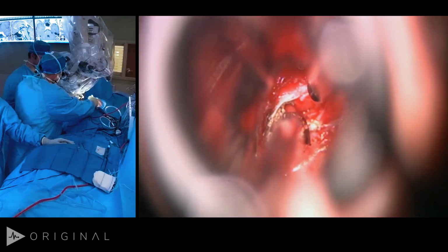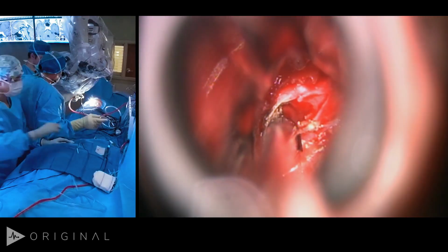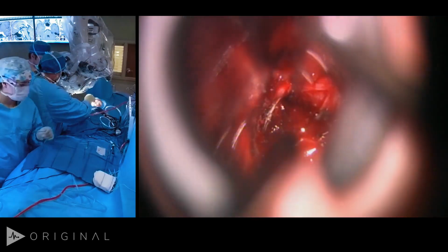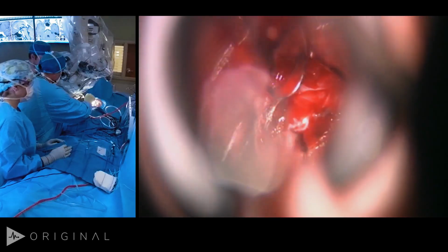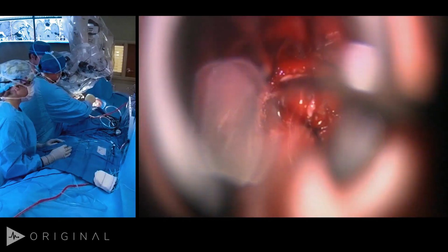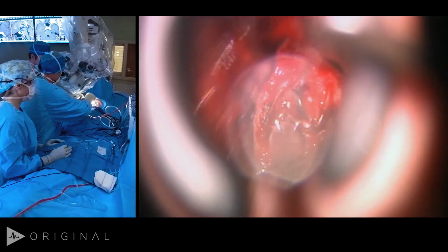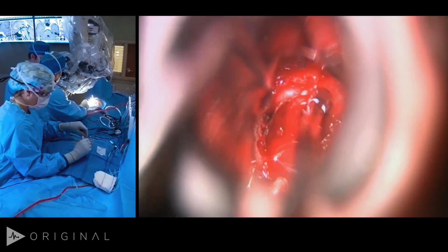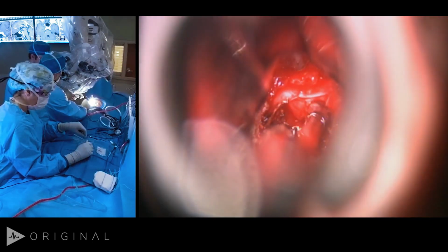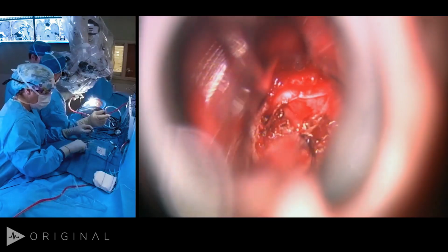You'll notice when I use that instrument on, I push the normal gland away so I don't burn it, bipolar. Sometimes if you can get a bipolar in, it's very helpful. I feel obligated to look a little on that side because I thought we saw what might have been a second adenoma. I must confess, that looks like that's that, isn't it? Punch, please. So this patient either had two tumors, or her Cushing's, why don't we send that off, had extended across midline, which would be unusual.